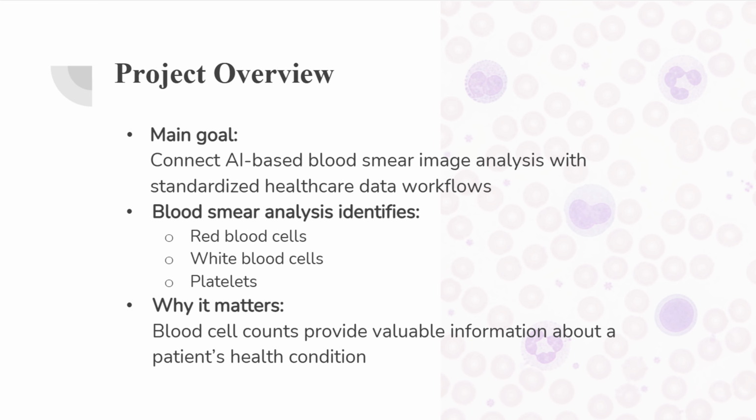In many healthcare settings, blood smear images are reviewed to identify and count different types of blood cells, such as red blood cells, white blood cells, and platelets. These results can provide important information about a patient's health condition.